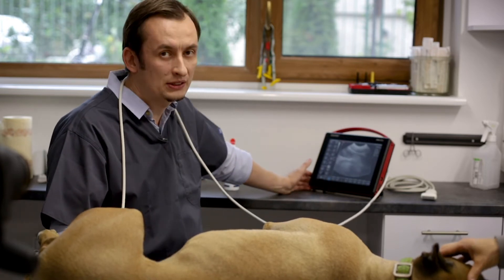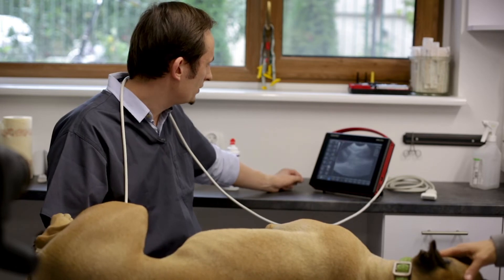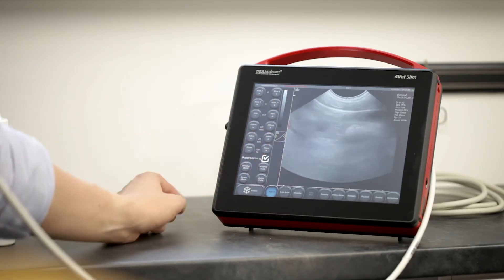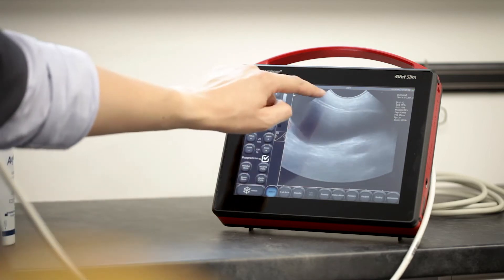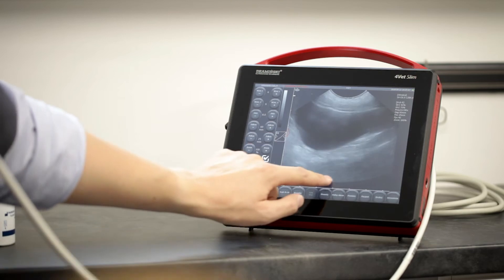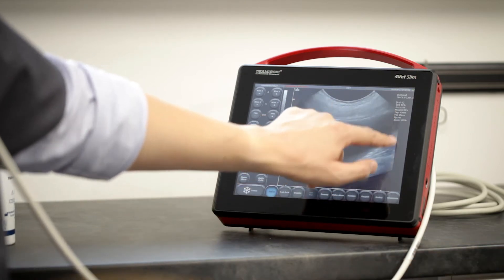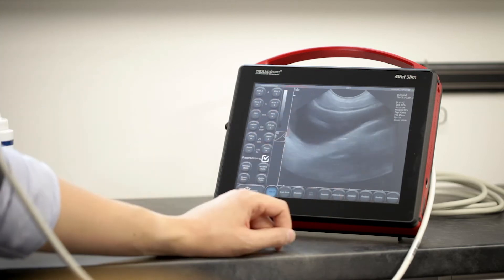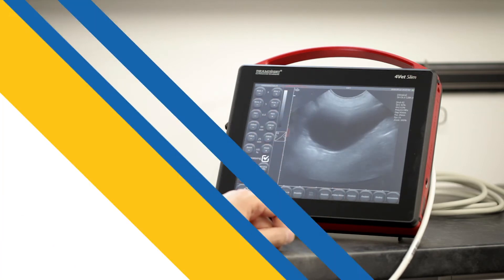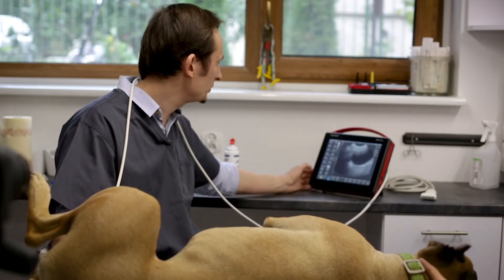On this device the basic settings can be adjusted by moving a finger in the active field. This is how I change the focus position, this is how I change gain 1, and here I can change gain 2. On the right side of the screen I'm changing the depth of scanning.